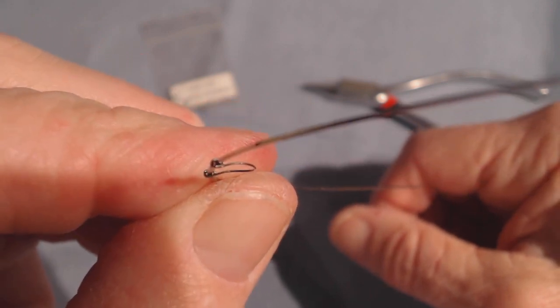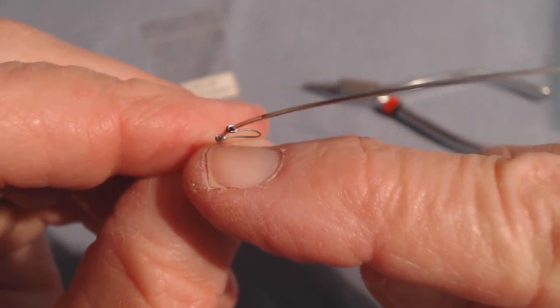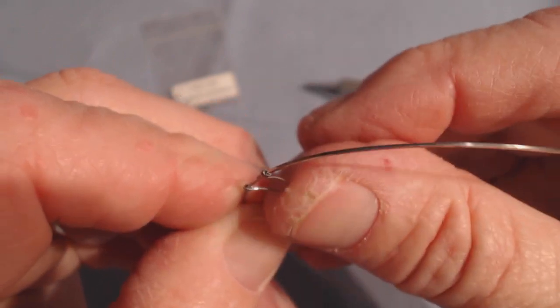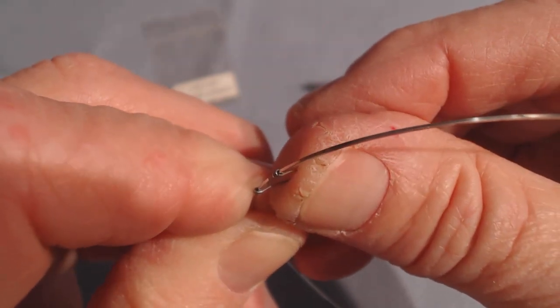And now, can you see, especially on this aspect down here, if I pick this up and I push this against the central incisor, the coil is going to be winding tighter and not looser.